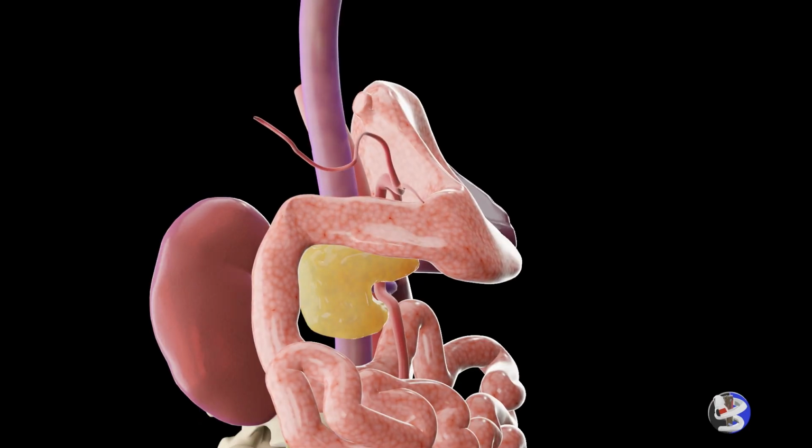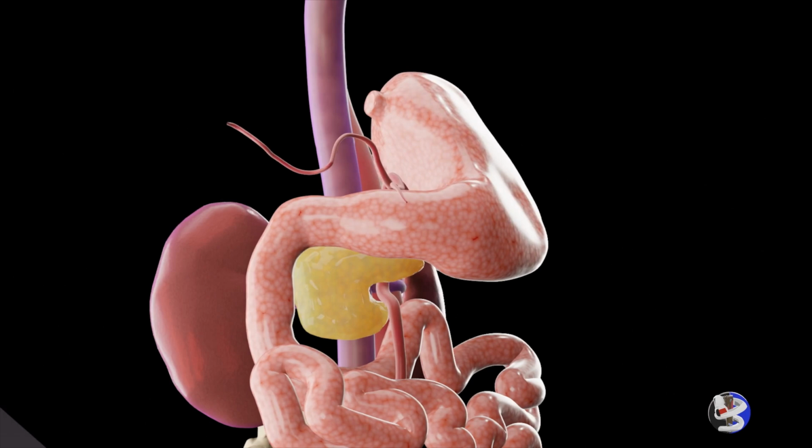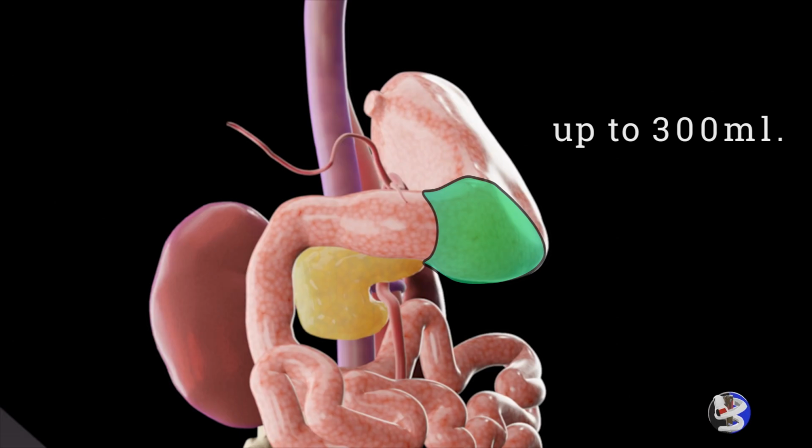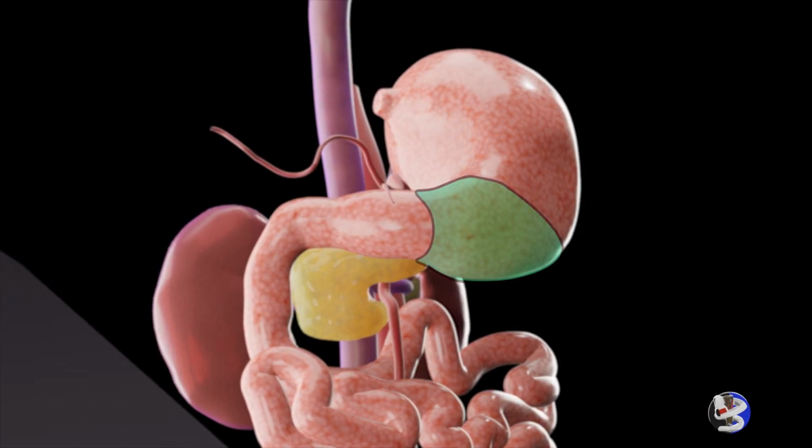As increasing volumes of liquid are ingested, an empty stomach expands to receive it. The gastric antrum increases in size in linear relation to that of the rest of the body of the stomach, up to 300 ml. Volumes in excess of this amount result in only modest further increase in antral size, with larger volumes being accommodated by more proximal areas of the stomach.